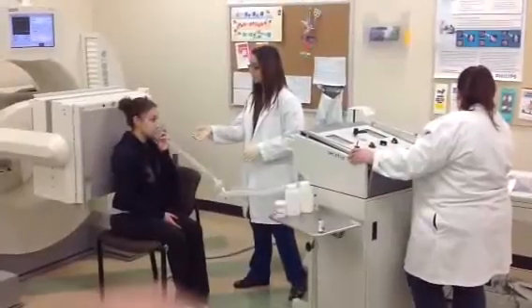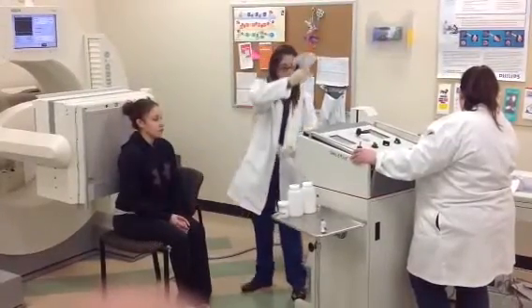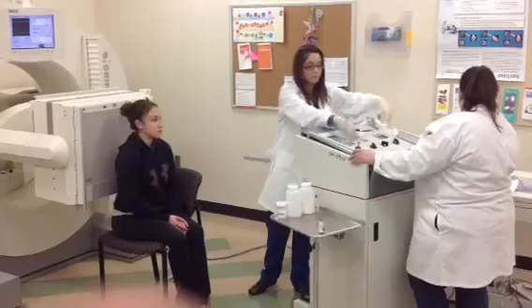When the washout is complete, remove the patient from the system. Allow the system to run for a few more seconds or until both bags are empty.